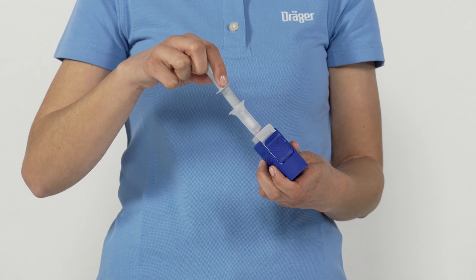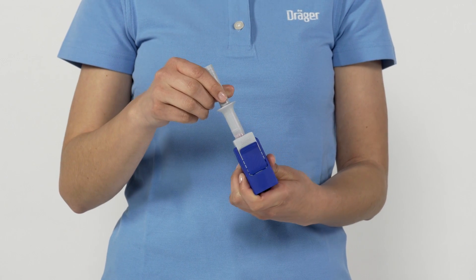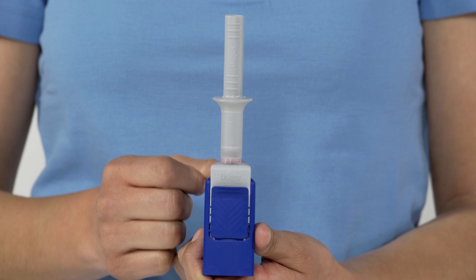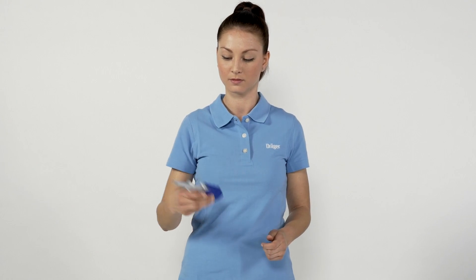Now push the sampler up to the stop into the funnel-shaped opening, so that the vial containing the buffer fluid in the test cassette breaks. There must be no gap between the sampler and the test cassette. Shake the test kit until the red indicator ring has completely discoloured.